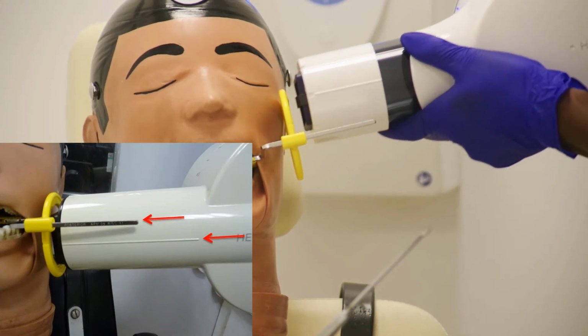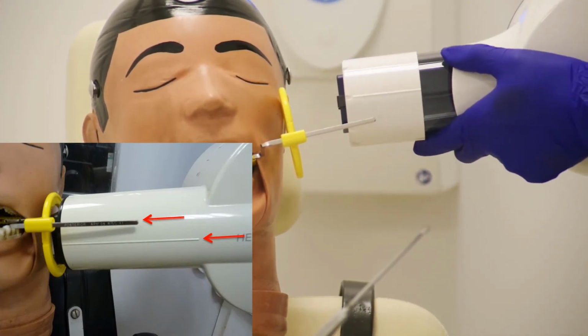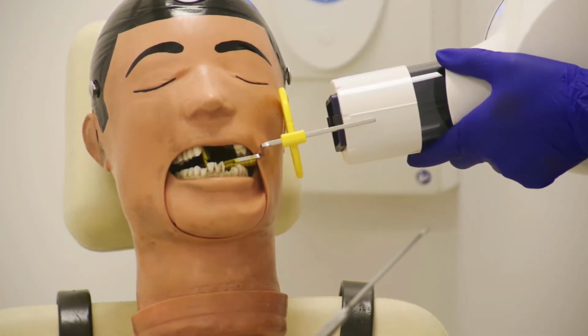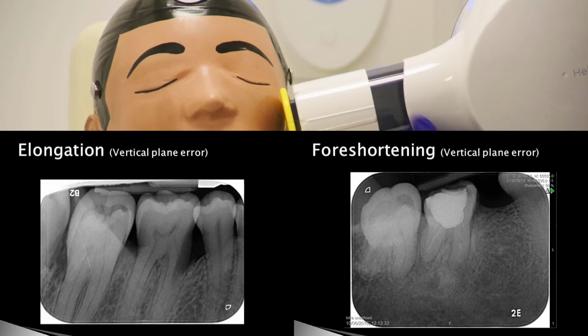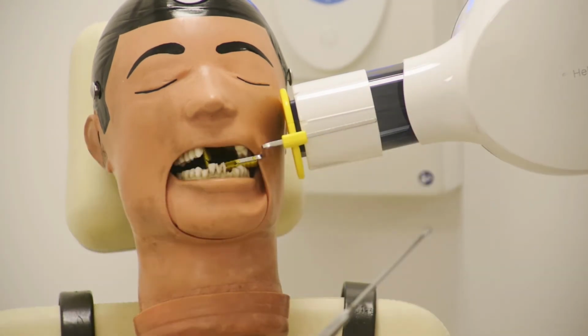So this is your vertical angulation, and you want to make sure that, as I mentioned earlier, it's perpendicular. If it's not, then you're going to get elongation or foreshortening. So you want to make sure that it's coming in perpendicular. I'm going to check it again, it's not properly aligned. Yes, now that is aligned. So we're going to show you what to do with the horizontal angulation to make sure that's also aligned.